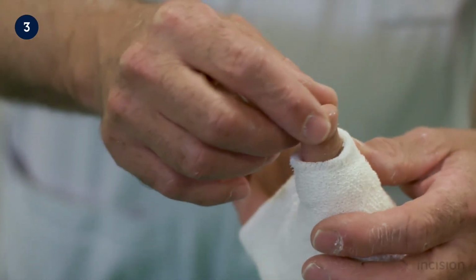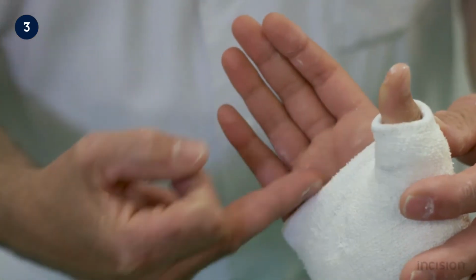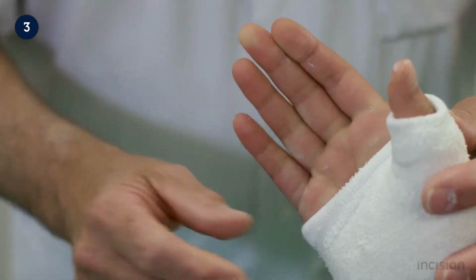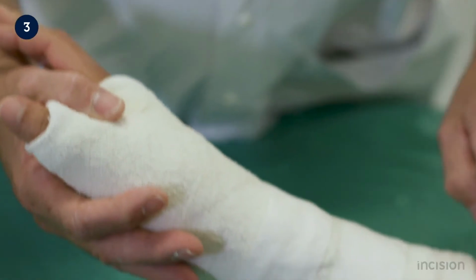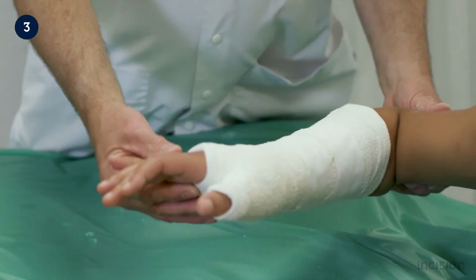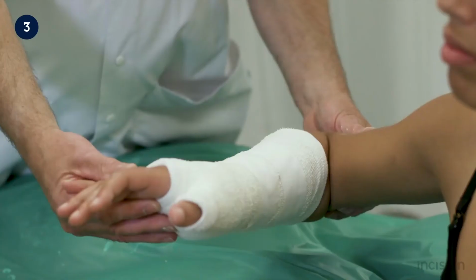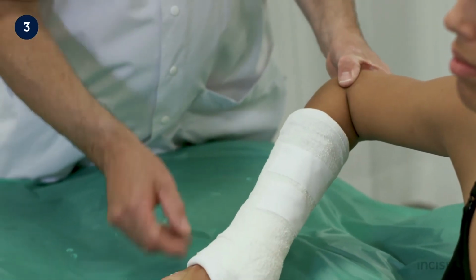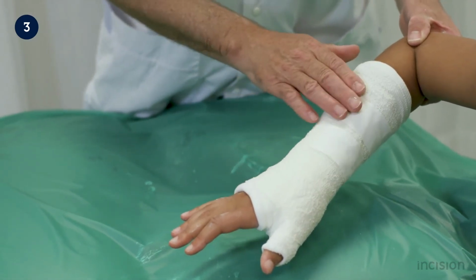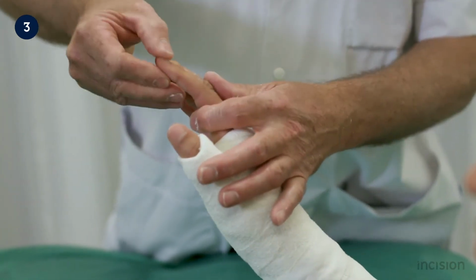Note that the interphalangeal joint of the thumb is not immobilized, and that the patient is able to flex and extend the metacarpophalangeal joint of the 2nd to 5th digits. Also note that the distance from the splint to the elbow crease is about 2 finger breadths. This is needed to adequately flex the elbow joint when placing the arm in a triangular bandage. Note that the thumb is in line with the radius because the plaster is molded in slight ulnar deviation. The capillary refill should again be assessed after the splint application is completed.